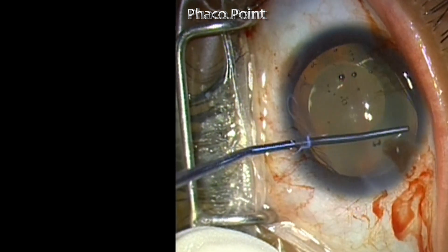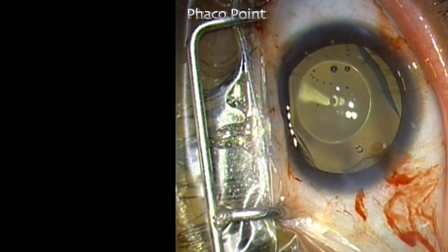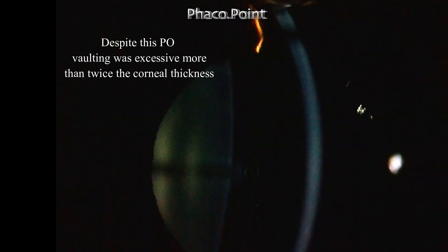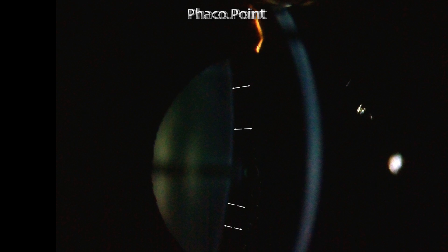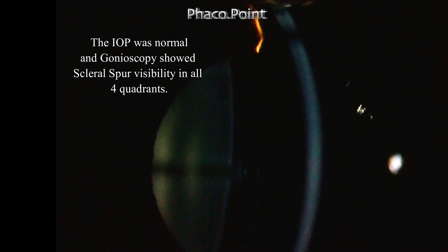In spite of taking all these precautions and sizing the lens as accurately as I could, the most important parameter — the vault of the lens — was a little excessive. It was slightly more than twice the corneal thickness in this particular patient, as you can clearly see.